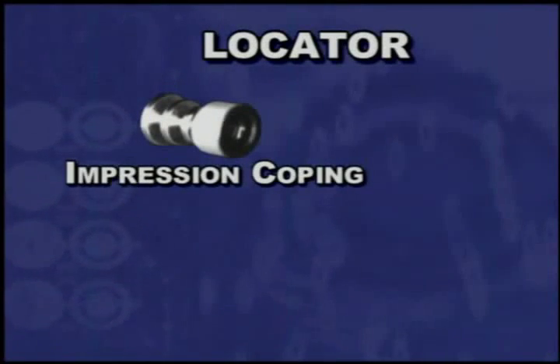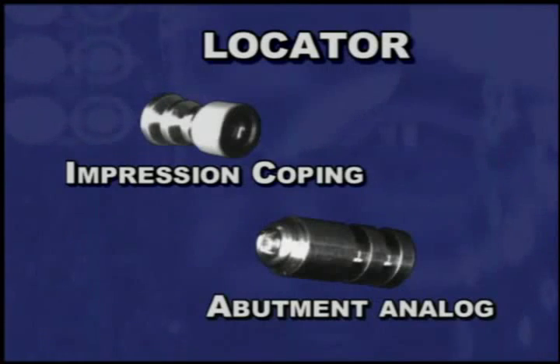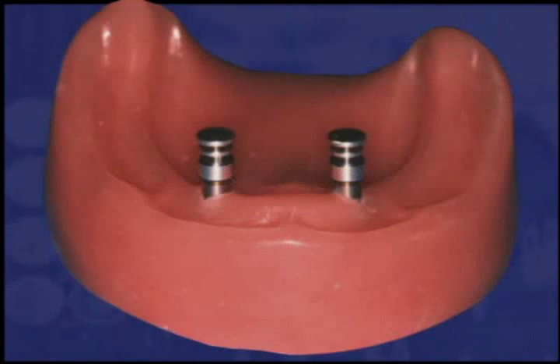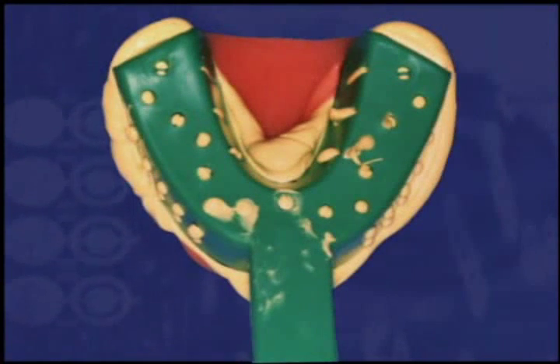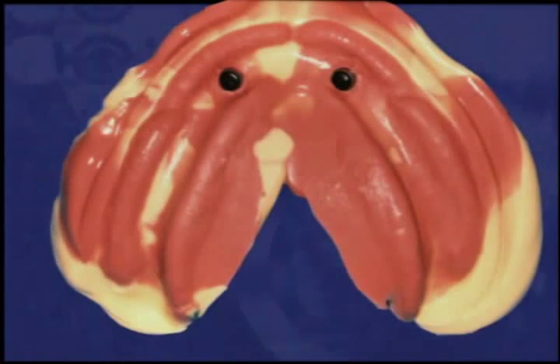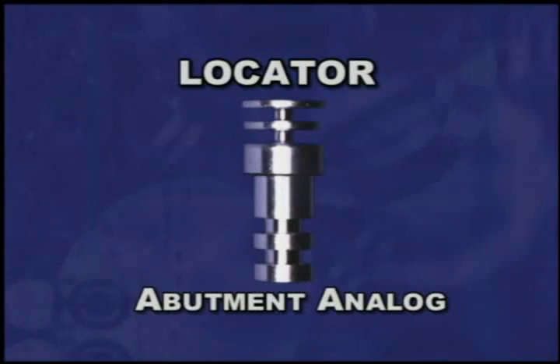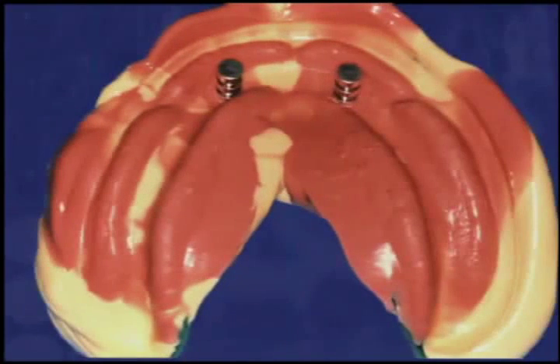A locator impression coping and abutment analog are used for the indirect processing of the denture cap male by the dental laboratory. Place a locator impression coping onto each locator implant abutment. Inject a light body vinyl impression material around each impression coping, then take a complete impression using a firm body impression material. The locator impression coping is designed with minimum retention to be picked up with the completed impression. The locator abutment analog is designed with a very precise fit into the impression coping, allowing for an accurate transfer for the working model. Snap a locator abutment analog into each impression coping, making sure they are fully seated.